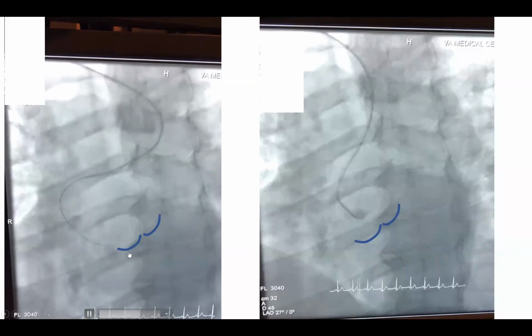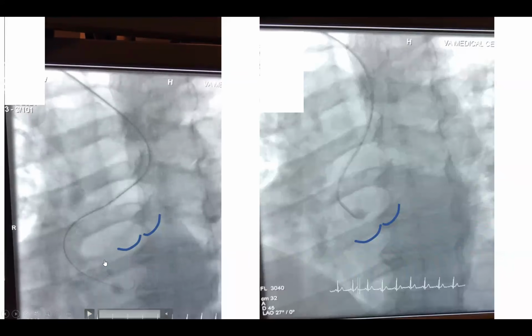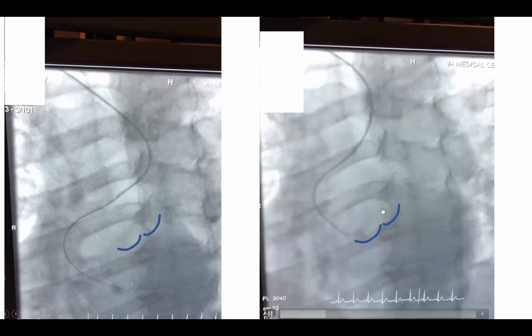Again, you have to be imagining in your brain, right and left cusp. Okay, look here, we got it. And we got it looking toward the left. Now, this is only the first step. You still have to jump, then engage. Okay, so we tried to jump here.